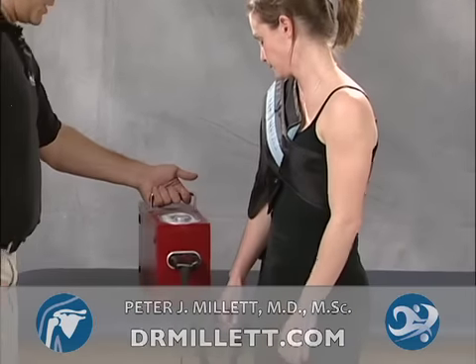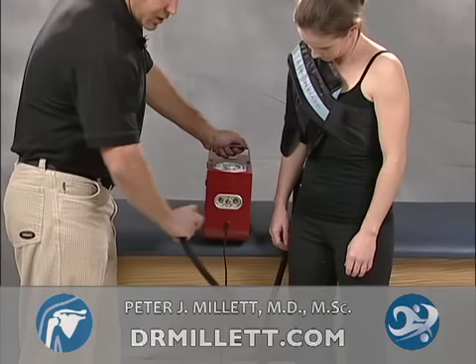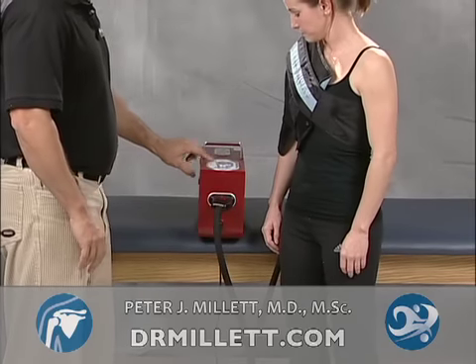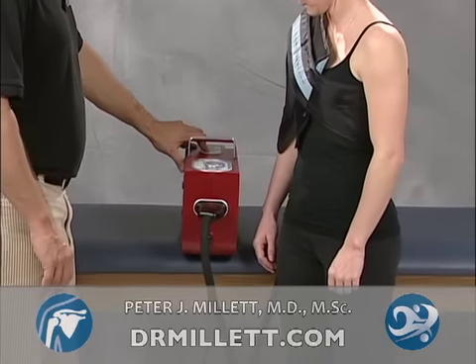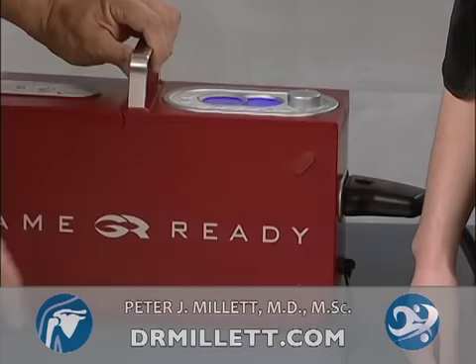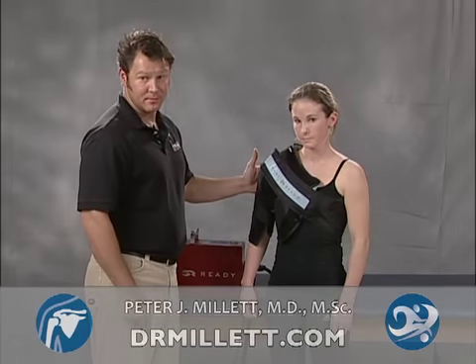The machine's on already. Be sure to check these hoses here. Sometimes if they're not connected correctly, the machine will give you an error. Now you can go ahead and hit the play button. As you hit this button, the start pause button, the machine will automatically send cool water to the cuff and pump it up with air if you have a pressure setting on.